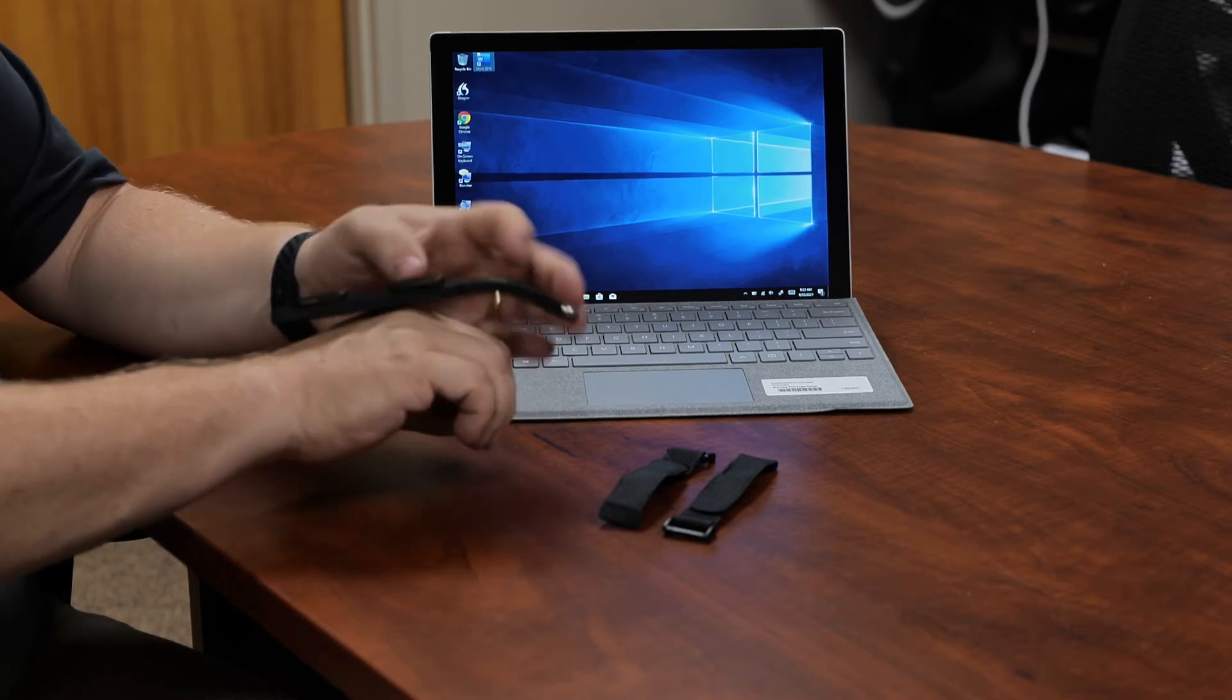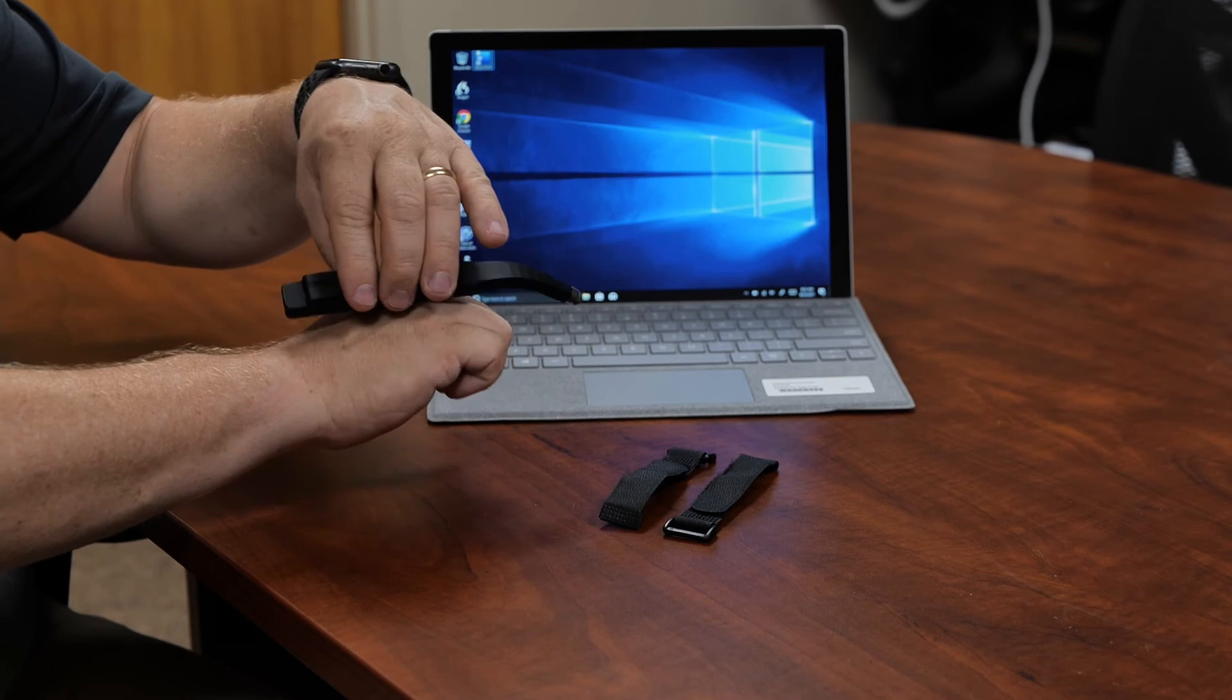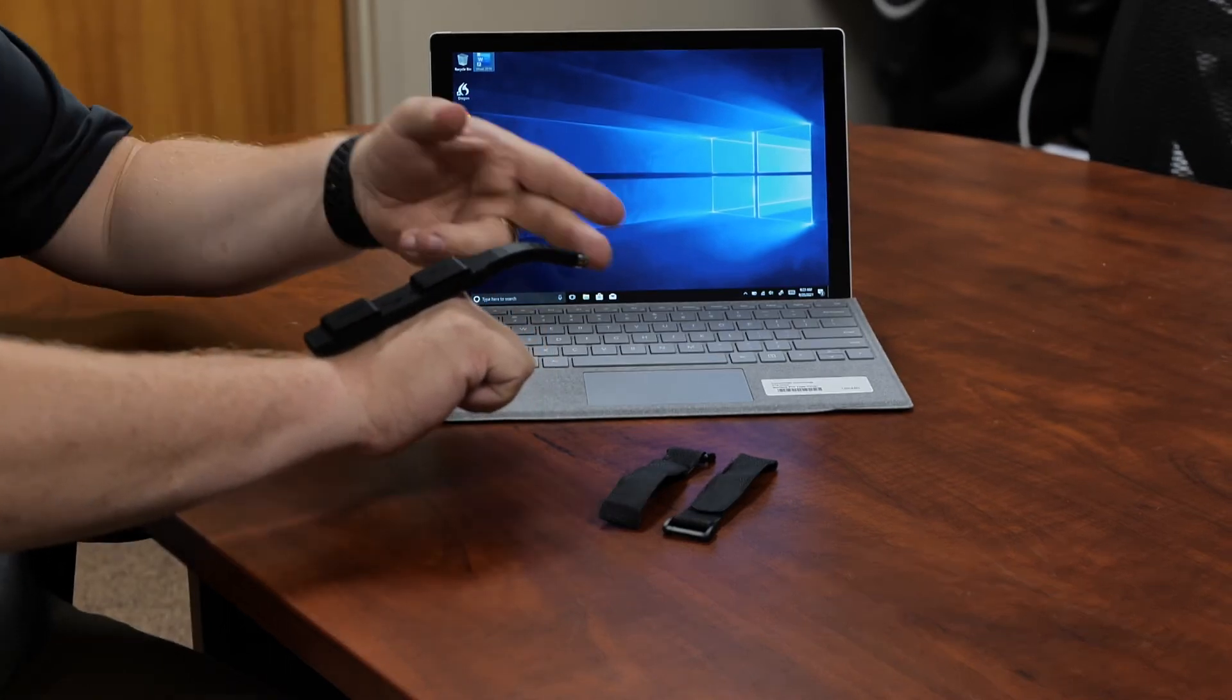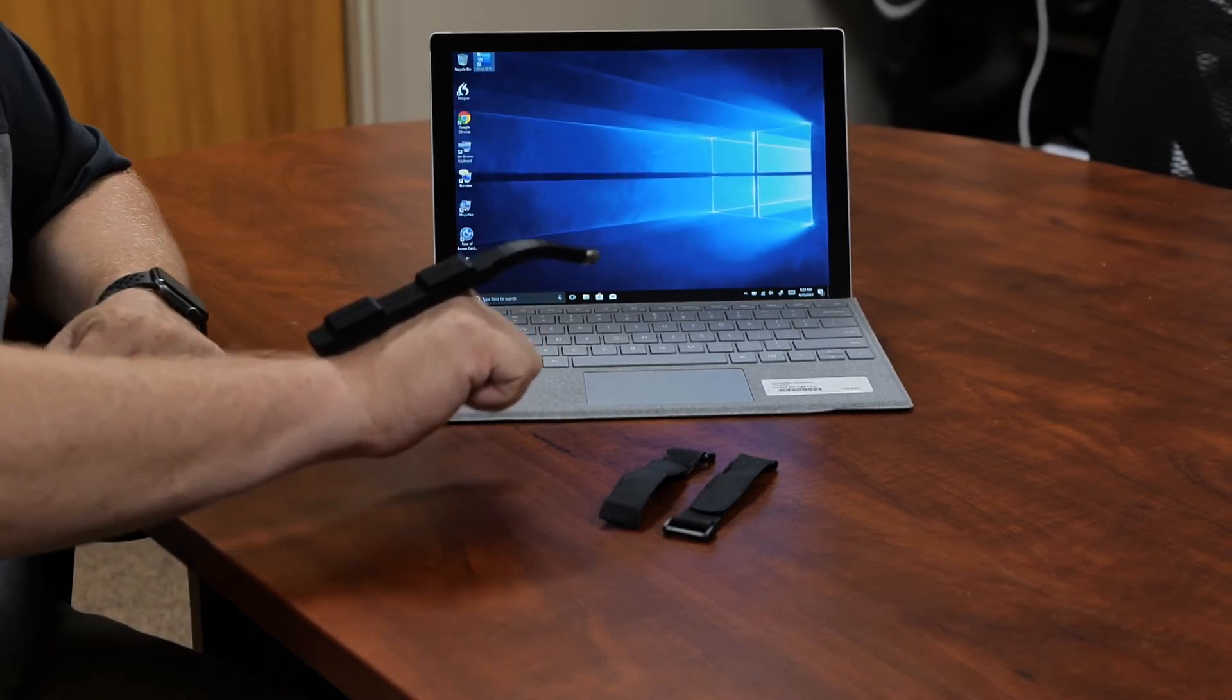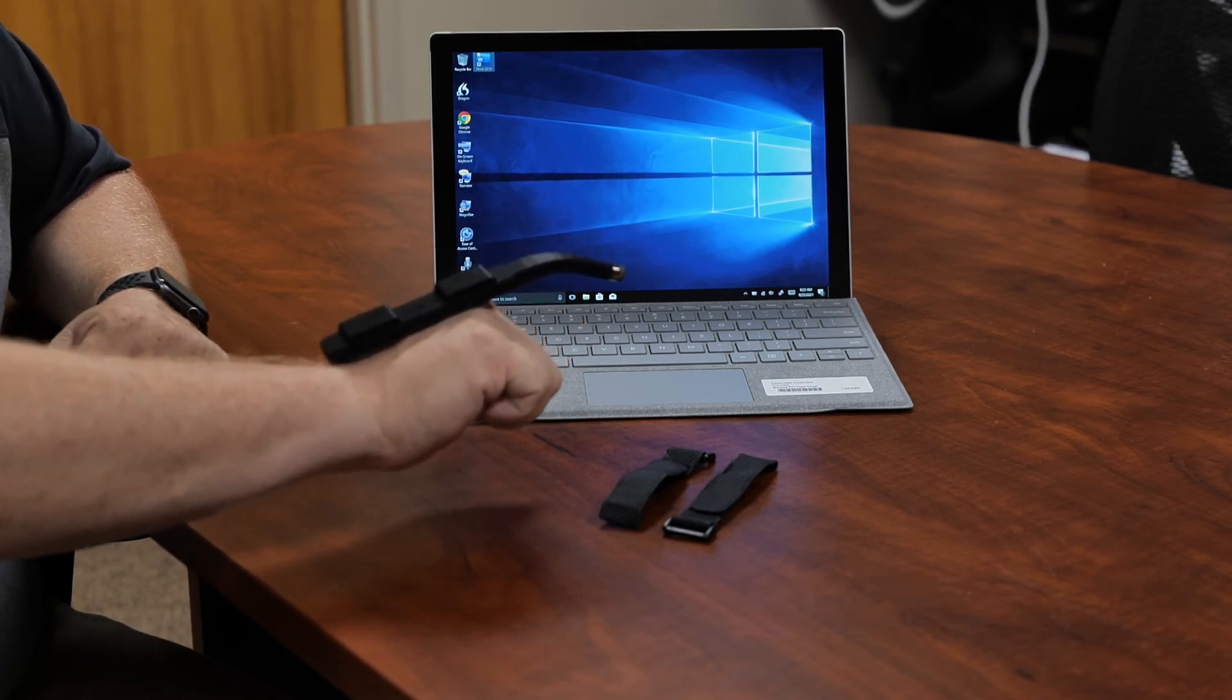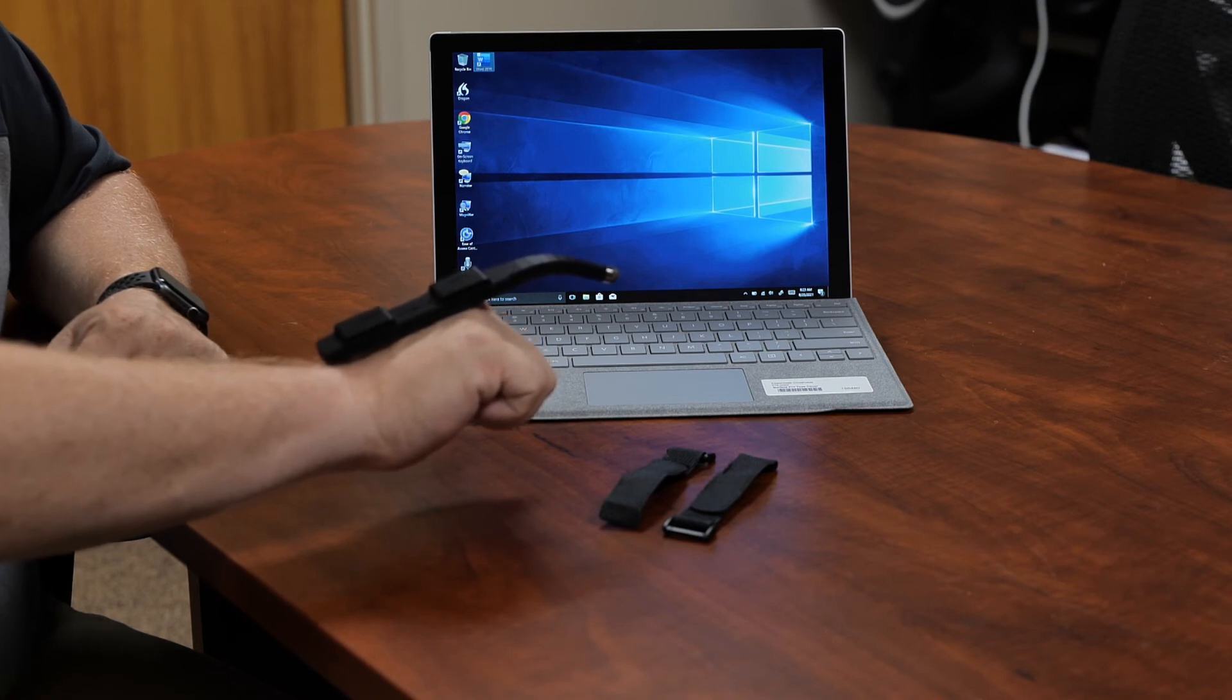But the way it does work is when you do attach it, it fits onto your hand like this so that you have the point out there and then you can simply move it around and touch things on the screen to turn those things on or off or to be able to activate functions or features on your devices.